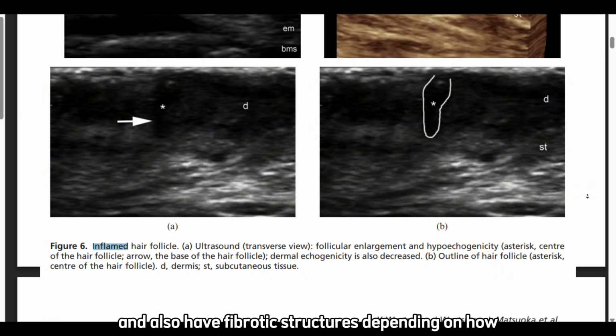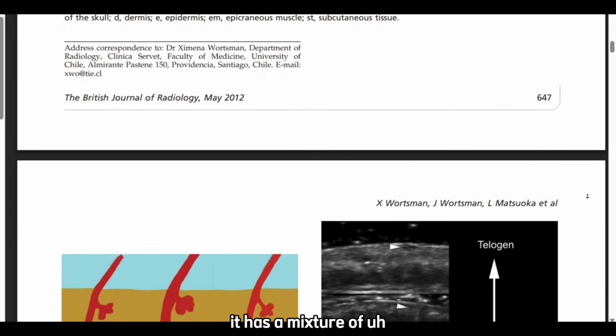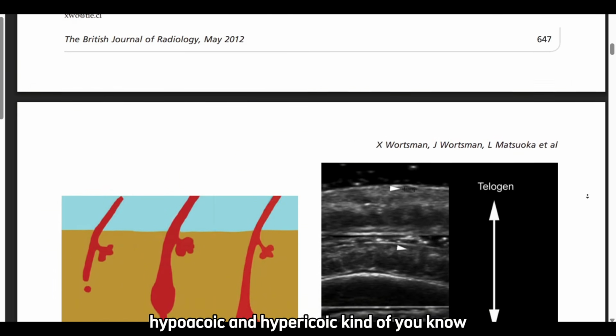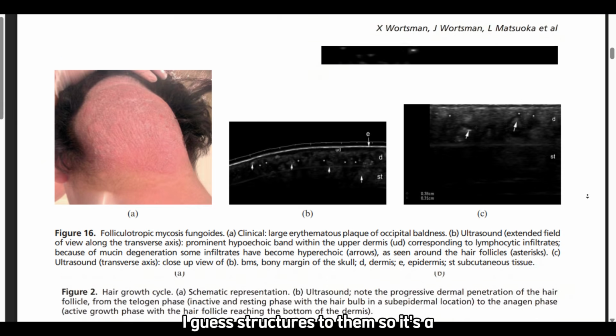And also how fibrotic structures, depending on how extreme the fibrosis is, have a mixture of hypoechoic and hyperechoic structures to them.